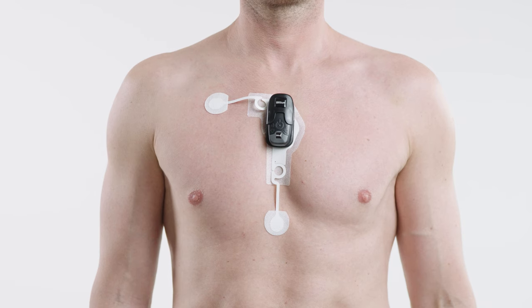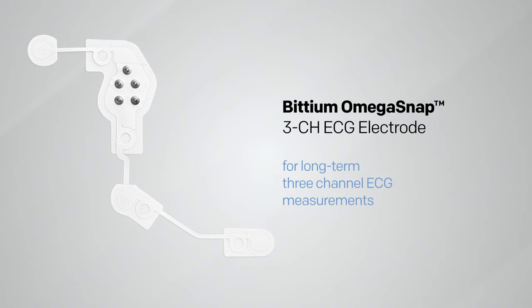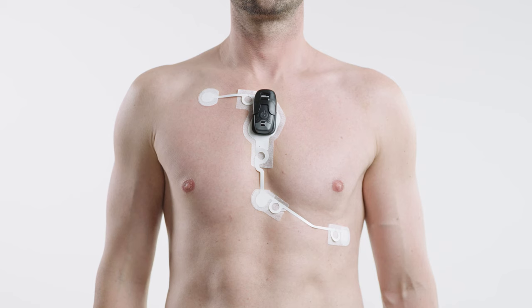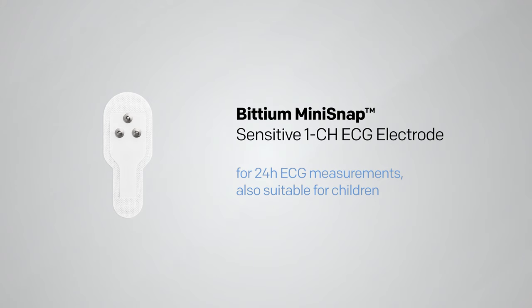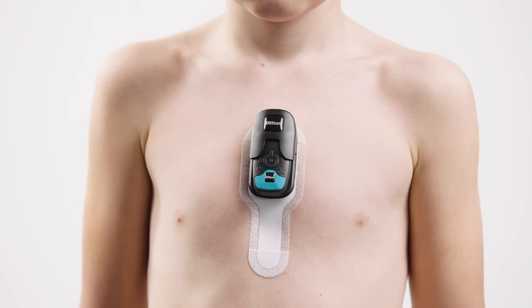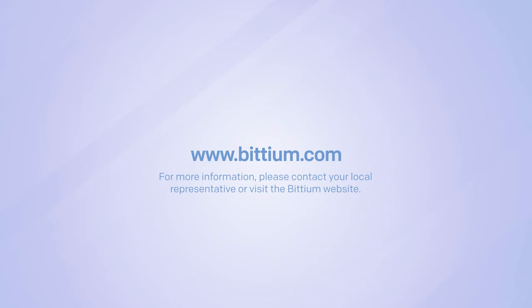The Bitium Omega Snap three-channel electrode is the most patient-compliant way to perform long-term three-channel measurements. The Bitium Mini Snap Sensitive one-channel electrode is the most suitable for 24-hour ECG measurements on small adults and children. For more information, please contact your local representative or visit the Bitium website at bitium.com.